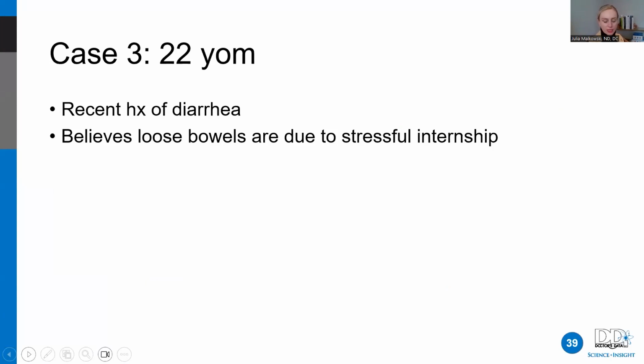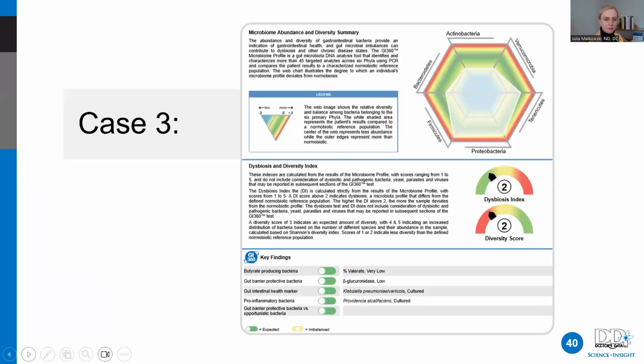And then our third case here is going to be a 22-year-old male. Recent history of diarrhea, and he believes these loose stools are due to a stressful internship. All right, let's take a look at this young man. Again, the first piece of information we're going to look at is the web.